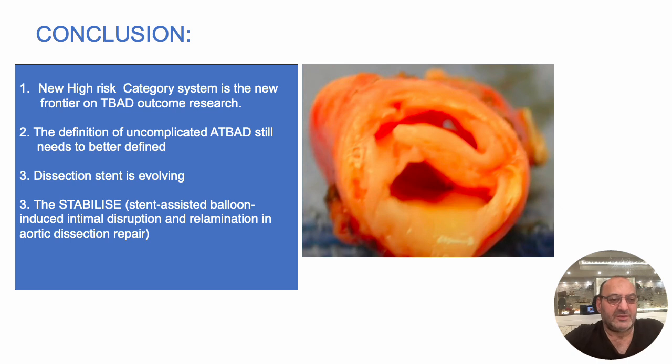But we don't have long-term data. Maybe if we would not have done ballooning, maybe most of these patients would have remodeled. So one has to be really, really careful with stabilized ballooning. If you do it, you have to have the right team, the right experience, and a non-compliant balloon.